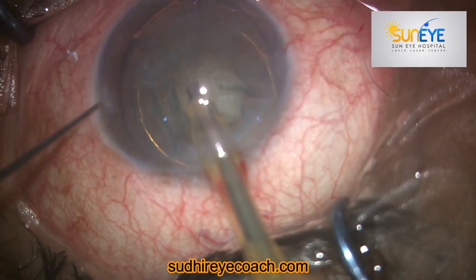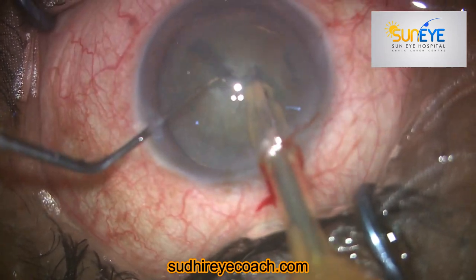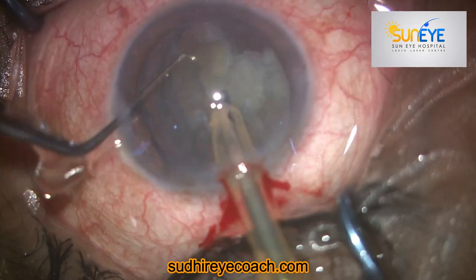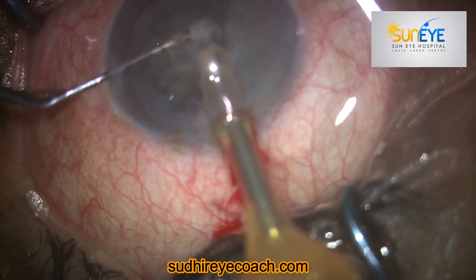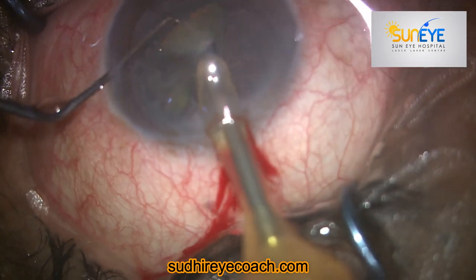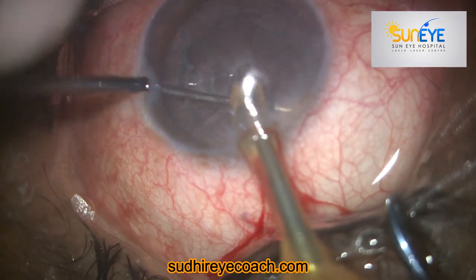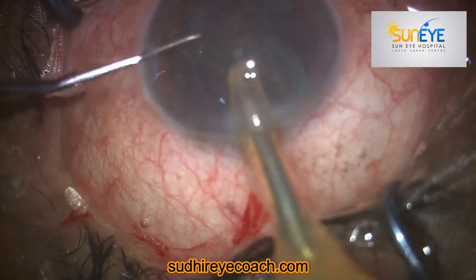As routine, I do fragmentation and normally I prefer to do vertical chopping. So I started the fragmentation and everything was going as per my expectation. I did vertical chop and fragmentation and I finished my fragmentation without much effort. Then I rotated the epinucleus plate and with low vacuum I started aspirating the cortical matter.